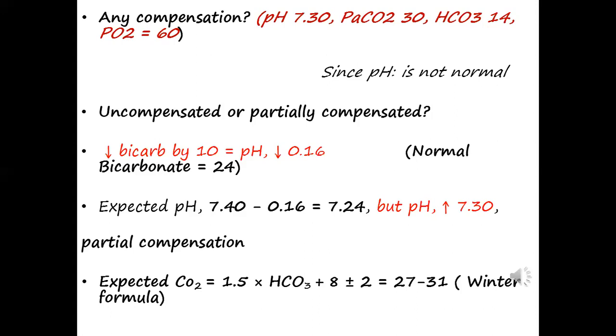Now, never complete your blood gas interpretation before looking at PO2. Here PO2 is between 50 to 70, so there is normoxemia. So to label this blood gas, we'll say that it is a metabolic acidosis with partial compensation with normoxemia. Never stop without commenting on oxygen, because it is not always hypoxia, but hyperoxia is also dangerous to neonates because of the free radical injury.